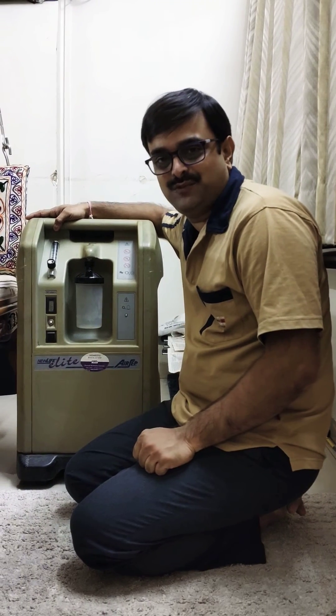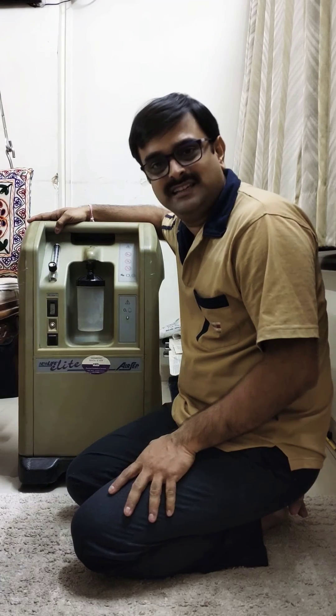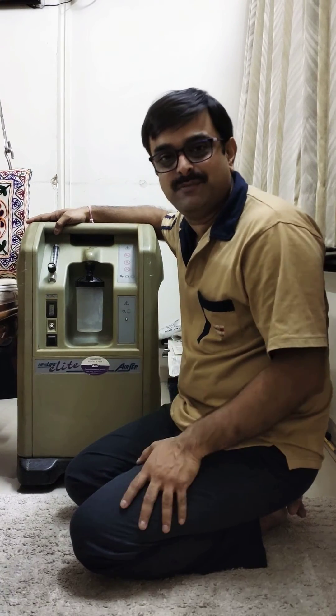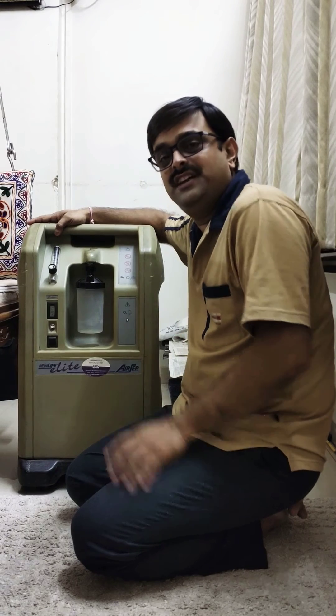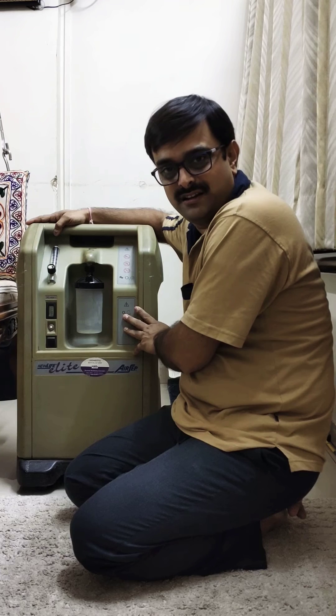Hi guys, I am Nimish from Pancholi Biomedical Services. My office is in Ghatkopar, Mumbai. Now as you have seen in my earlier video, it was the instructional video on how to use an airship oxygen concentrator.